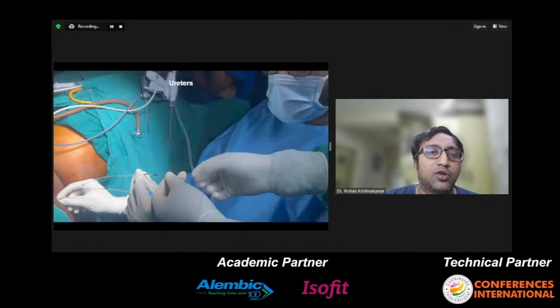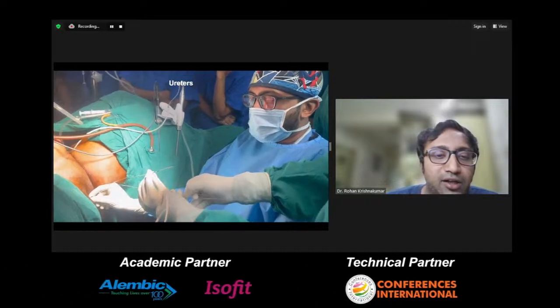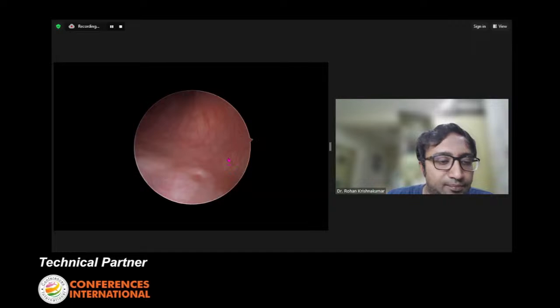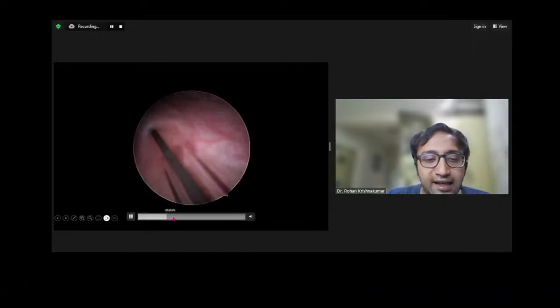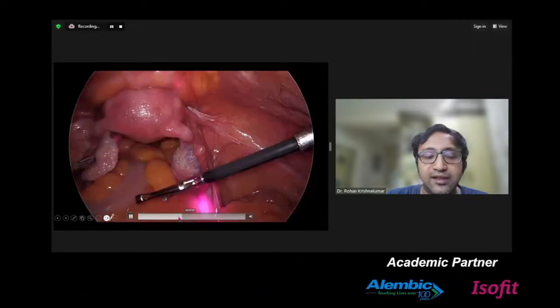Going further ahead, if you want to start off doing difficult surgeries, you might use these LED stents in the ureter. You can stent the ureters this way and put them through, past these LED stents. I'll just fast forward to save time. Yes, you can see this is how the stents work.